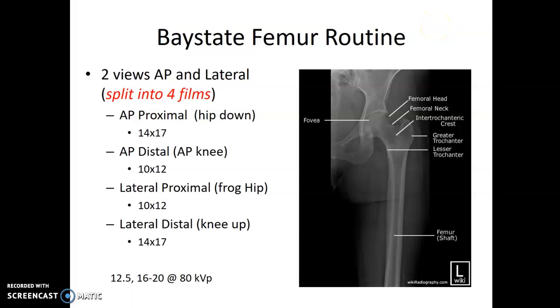Femur protocol is technically two views, an AP and a lateral, but because of the length of the femur, you end up taking about four films in reality, depending on how long they are.